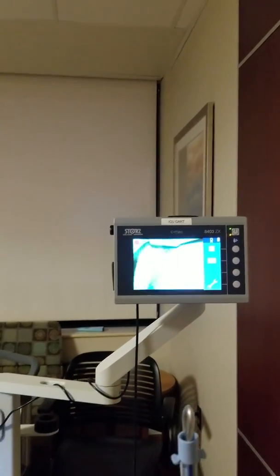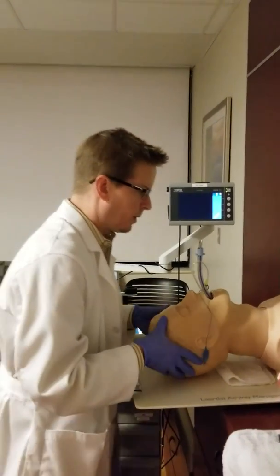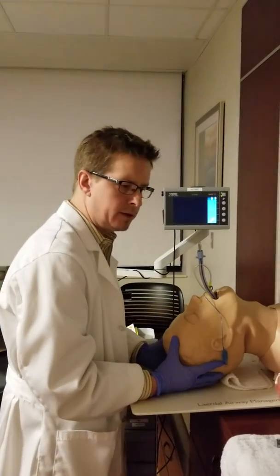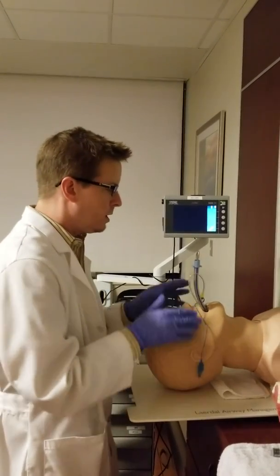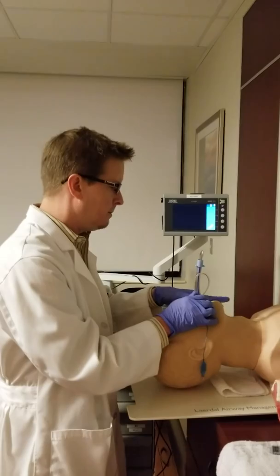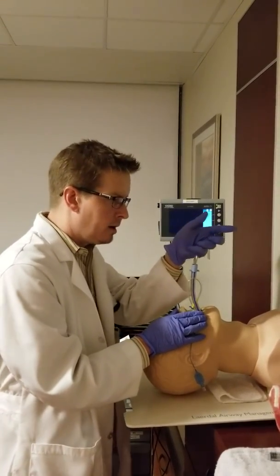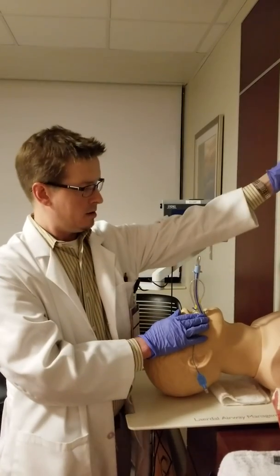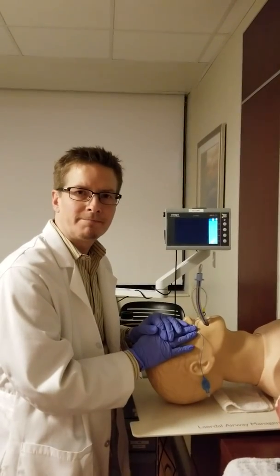So the take-home message is this: don't forget to lift and sniff. And sniffing is not just pulling the head back — it's also bringing the head forward. Lift and sniff. Take your time. Advance and lift away from you, and that will open right up for you. There's intubation.